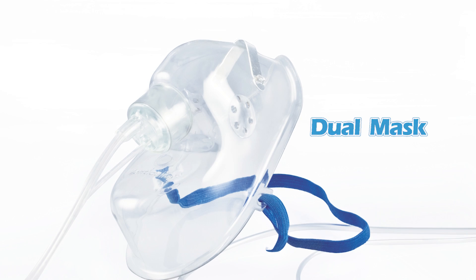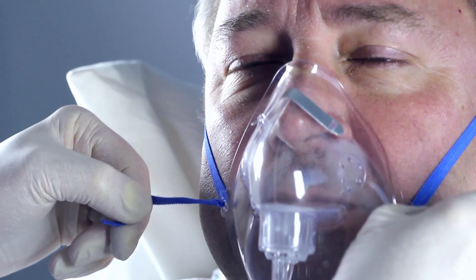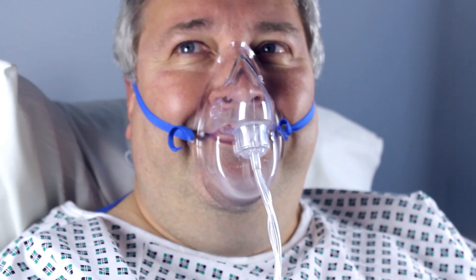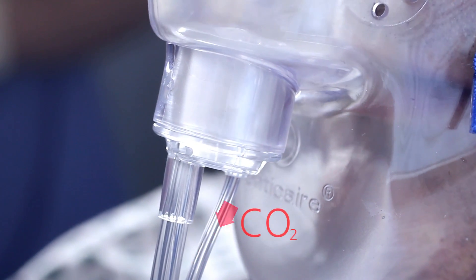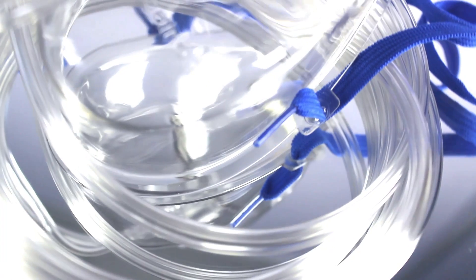Fresh oxygen is delivered to both nostrils via the lower prongs of the dual nasal cannula. The dual capnography mask delivers accuracy with every breath. The mask can be fitted comfortably over the ears and secured with the head strap. The soft, pliable mask molds easily to the patient's face, whilst the feather rim provides maximum comfort. The mask is made of soft transparent PVC to allow clear visual inspection.